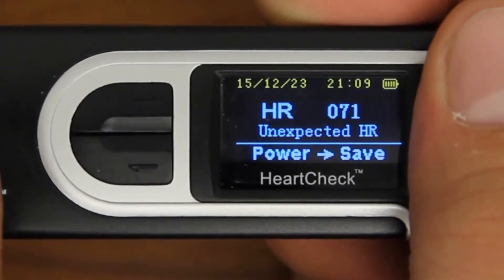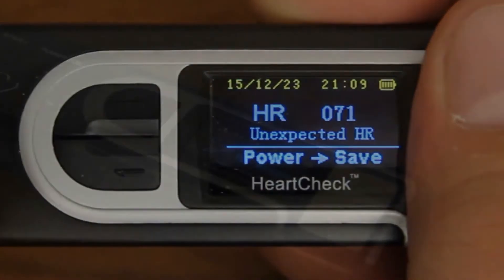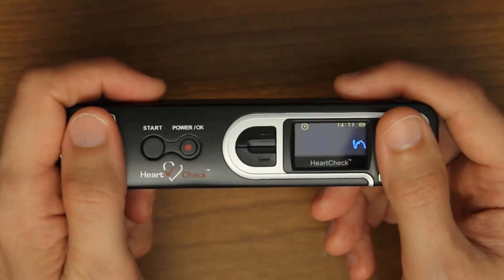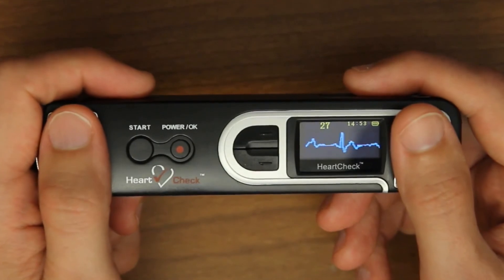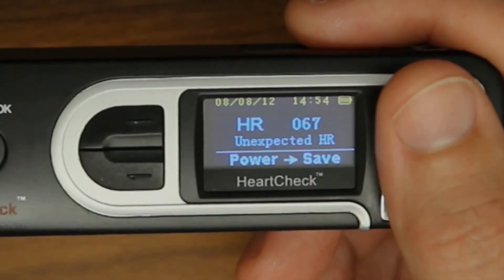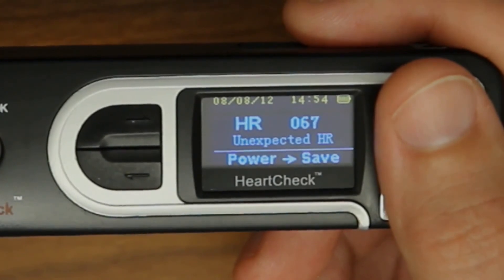If this is the first time using the device, or if you haven't used the device in a while, try repeating the reading process up to three times to allow the device to adjust to your body type. If after repeating the reading process the device continues to display the unexpected heart rate message, try taking a chest measurement.